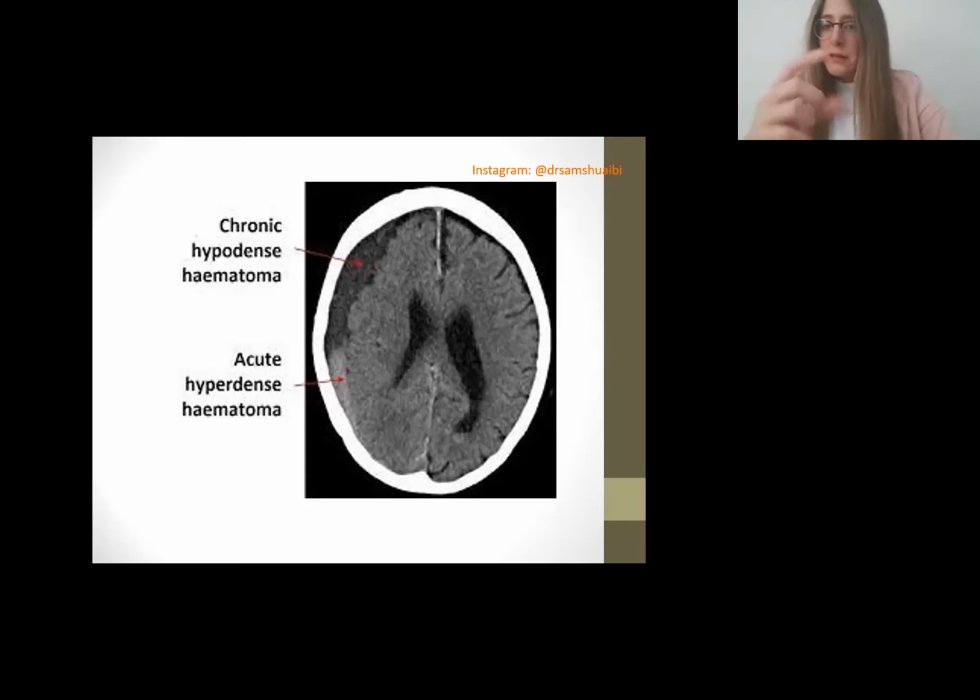But you can tell that there's a difference. There's a hyper and hypo, and I'll explain it. You will come out of this lecture, you will see it, you'll answer it, and you'll go to sleep straight away. It's going to be very easy for you to understand.